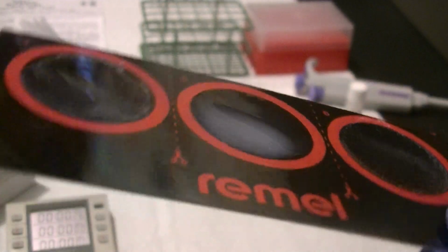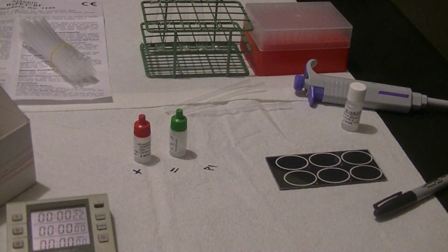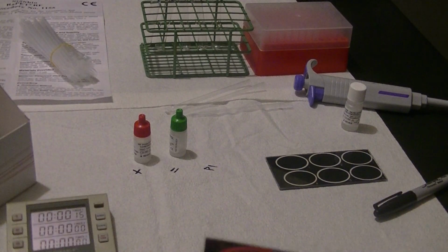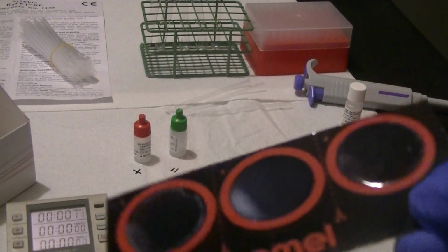Our patient sample, we can see, is showing us that reaction, but we still need to make sure we rotate the card for a full 2 minutes. If we had a patient sample that looked negative, we want to make sure that we give it the full 2 minutes so that antibodies will have a chance to come into contact with antigens.